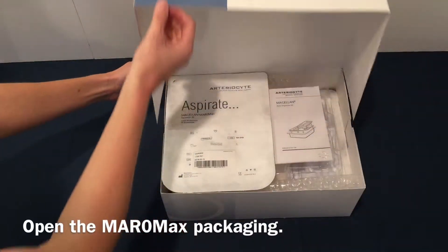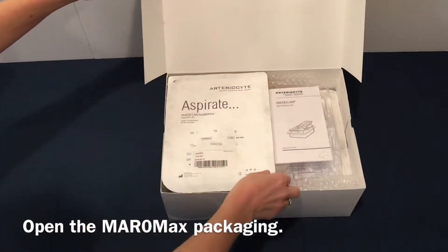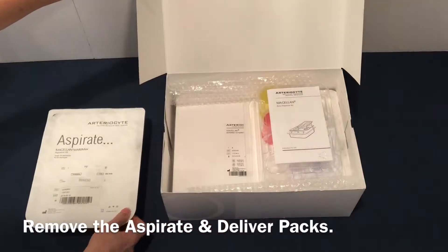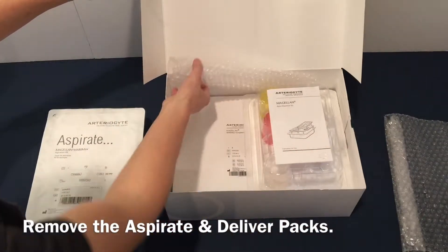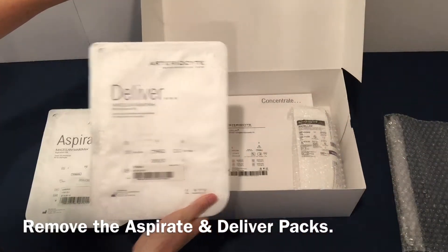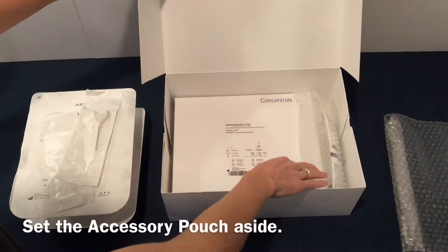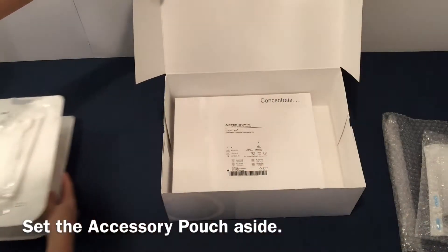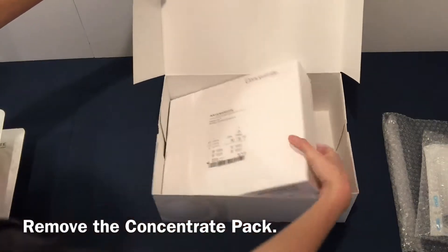Open the MAR0Max packaging. Remove the Aspirate and Deliver packs. Set the accessory pouch aside. Remove the concentrate pack.